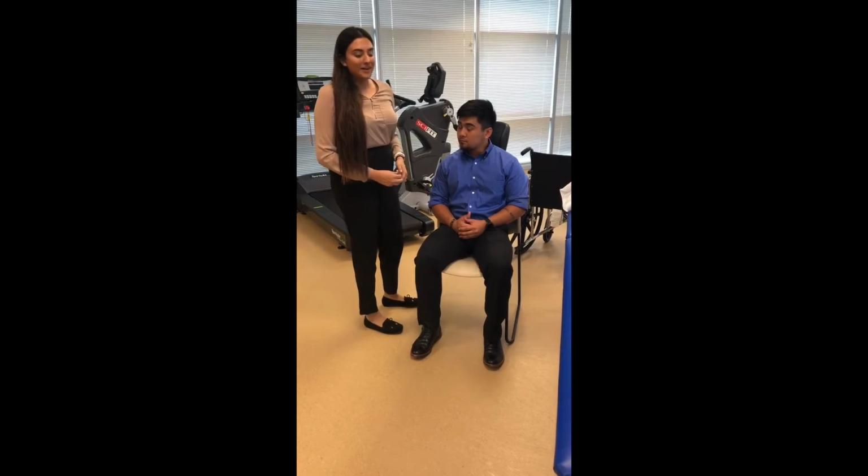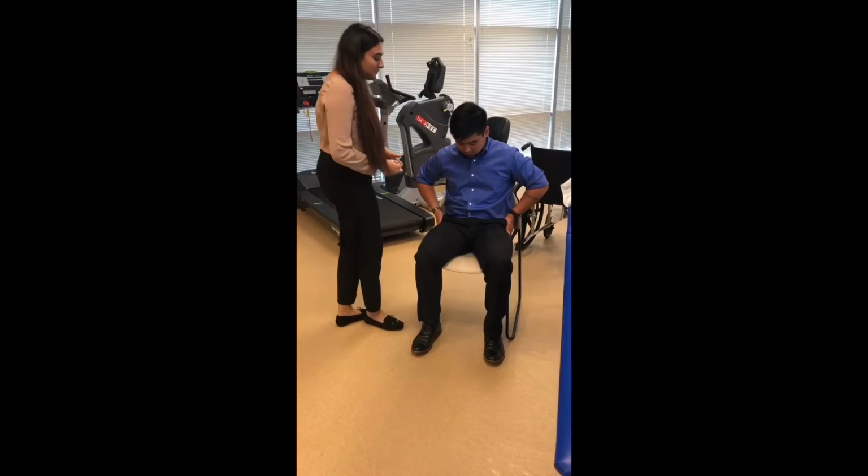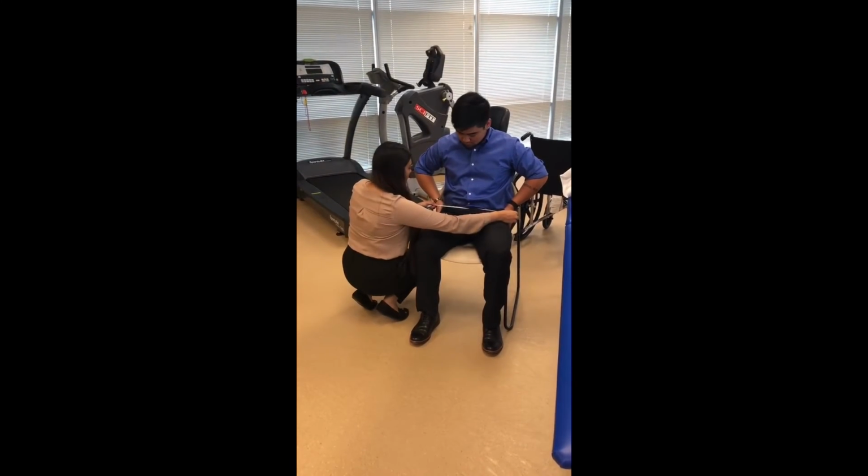So next we're going to measure seat width. So I'm going to have you place your hands on the side of your hips. We're going to measure from one hand to the other.